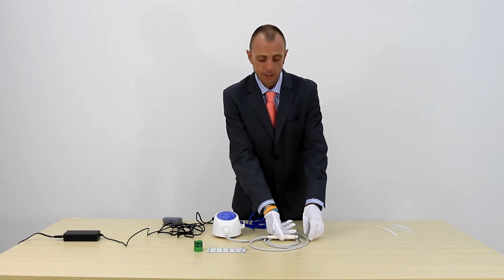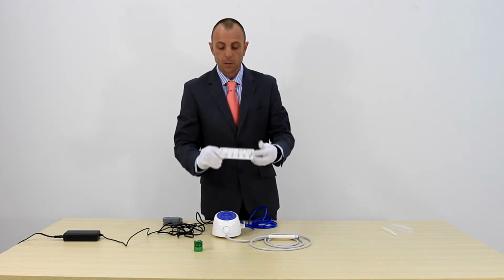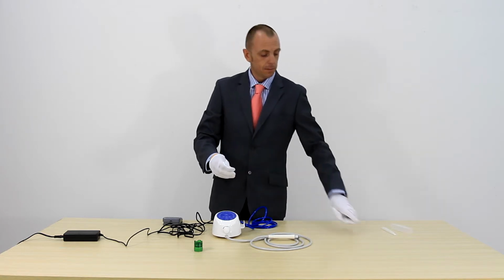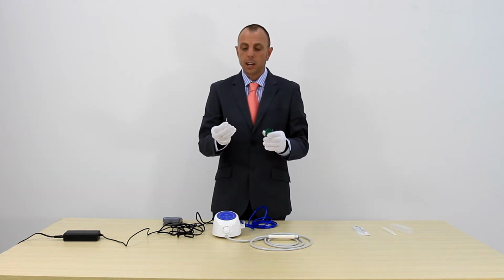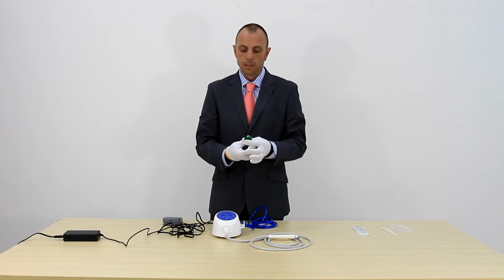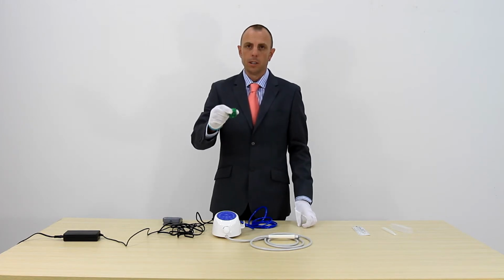Next thing we need to do then, put the scaler tip onto the handpiece so we can actually use it. Remove one of the scaler tips from the pack supplied with the machine, and then push the scaler tip into the bottom of the scaler tip torque wrench. When it's pushed all the way in, you can turn the torque wrench the right way up and the tip will stay in, it will not fall out.